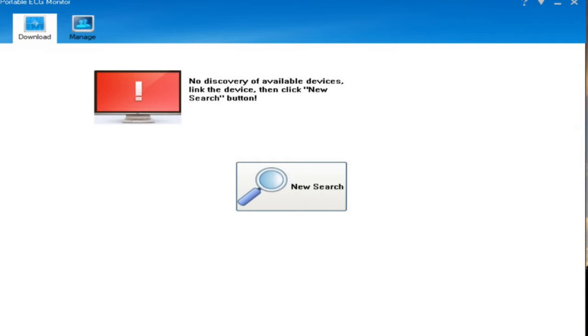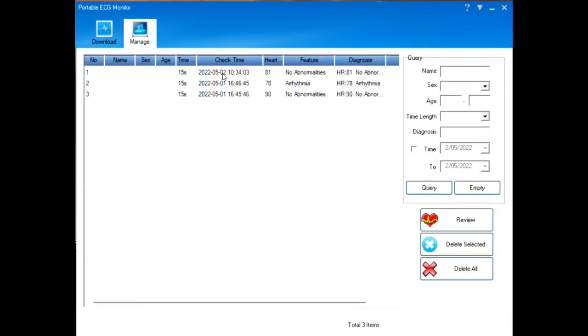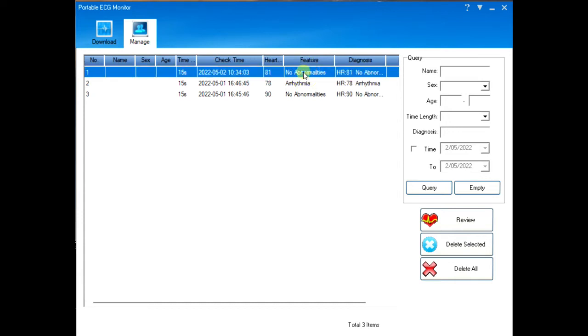What you have to do is plug the device into the USB socket on your computer. These are the three readings I have on my computer: the one at the top is the one I've just made for you, this one I made earlier, and this is when I was feeling less than well. Let me show you the one I've just taken — double-click and there we have it.